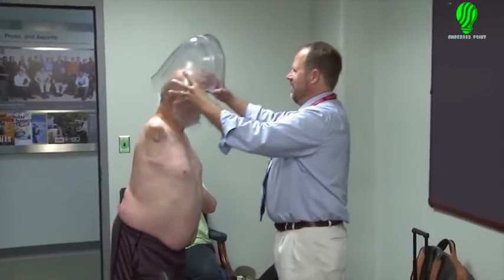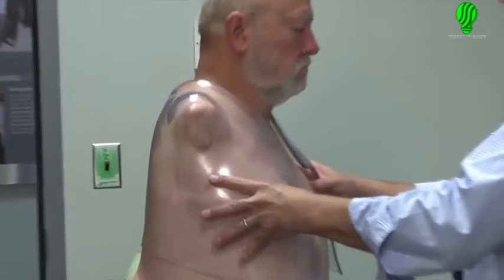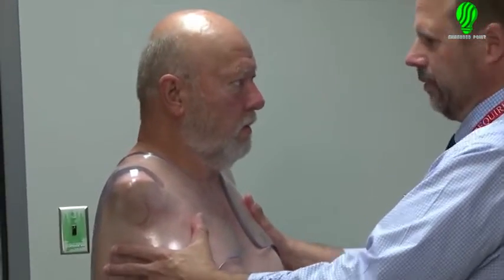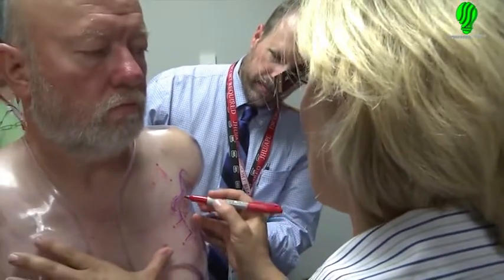On this day, Les is being fitted for his socket, which is sort of a body brace that makes the neural connections with the re-innervated nerves, as well as supports the prosthetic limbs.